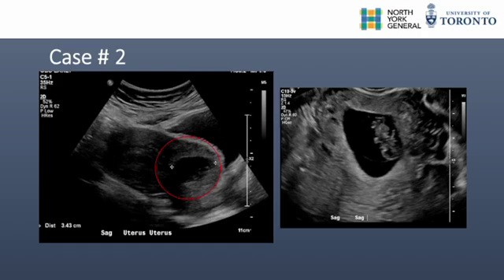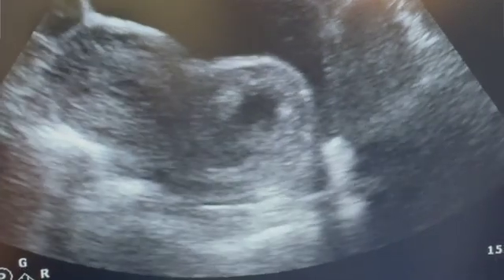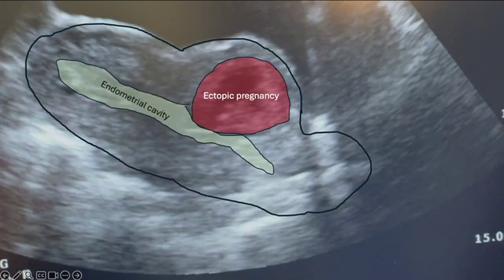After being counseled on medical and surgical options, the patient opted for surgical management. Like the first case, the bladder was retrofilled and vasopressin injected into the cervix. Here we can clearly see the type 1 c-section scar ectopic pregnancy on real-time transabdominal ultrasound scanning. A 10mm suction curette was used without need for dilation, and we can see the involution of the gestational sac as it is pulled into the suction tubing.